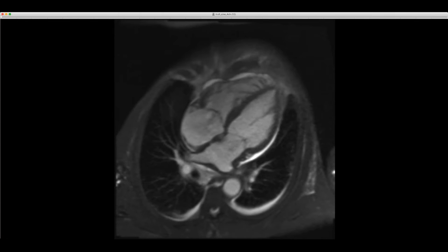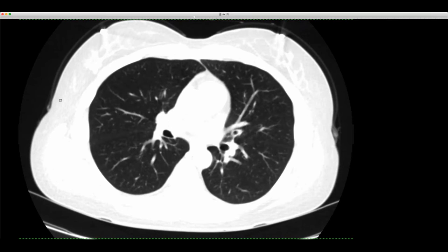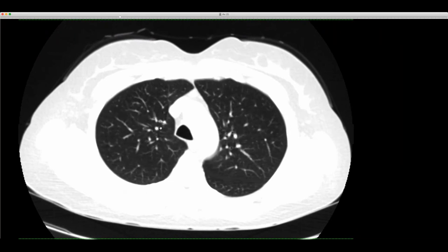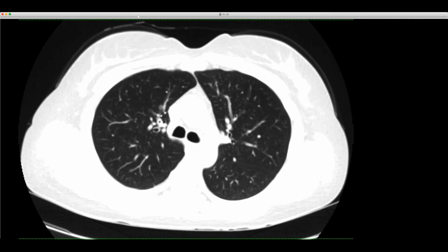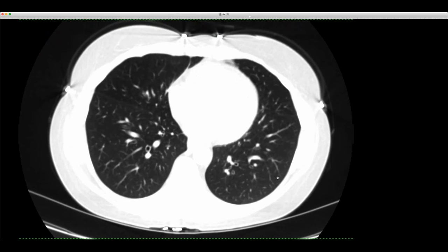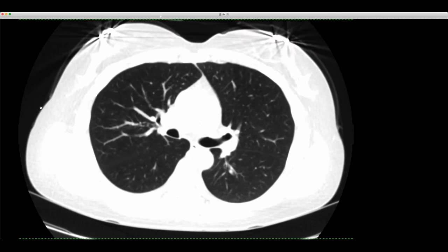Going back to the lungs for a second. This is a patient who has this CT, and I love this case because it underscores a certain differential. This is a 45-year-old patient whose only abnormality on this chest CT is bronchial thickening. You can see it's more subtle on the left, but on the right — certainly in the right upper lobe — it's pretty pronounced bronchial wall thickening. After I exhaust the common things that can cause this, like asthma, acute bronchitis, chronic bronchitis, and smoking.